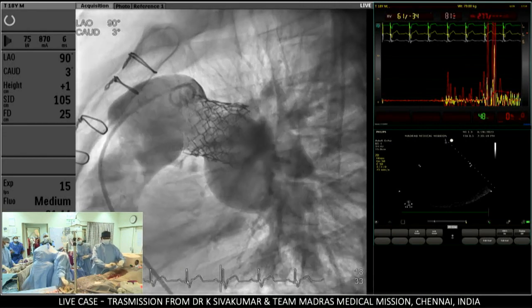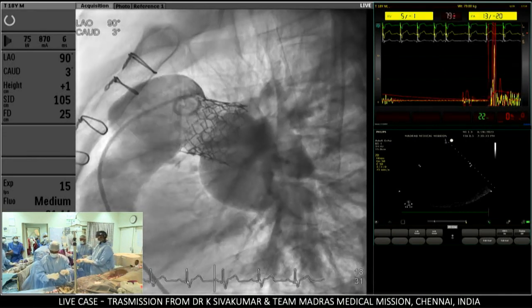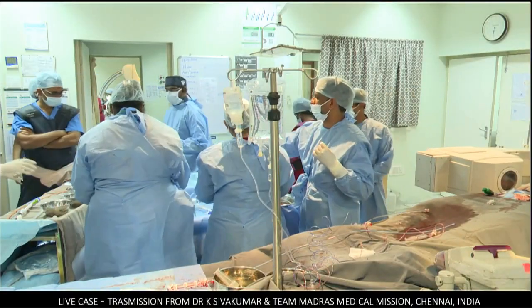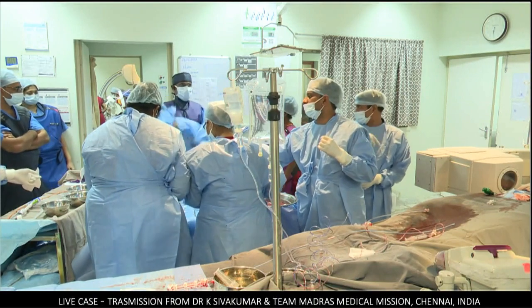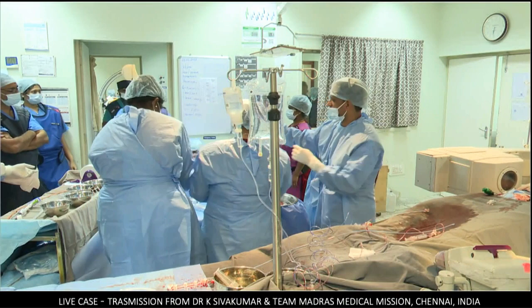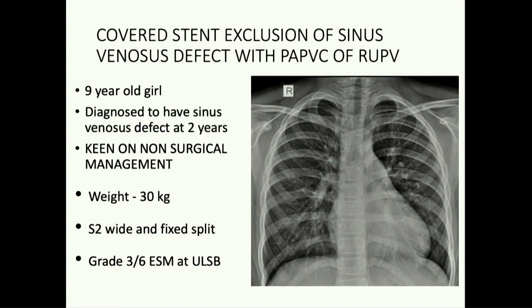Nice result. So what we'll do now, Shaq, is there is a very interesting covered stent exclusion of a sinus venosus defect in the other lab, and I am marching there. I would like the presenter to give the PowerPoint presentation. Shiva, yep, I'm hearing you, Shaq. Tell your team in the cath lab they've done a brilliant job, including the one who was doing the inflation. Big hand for them.